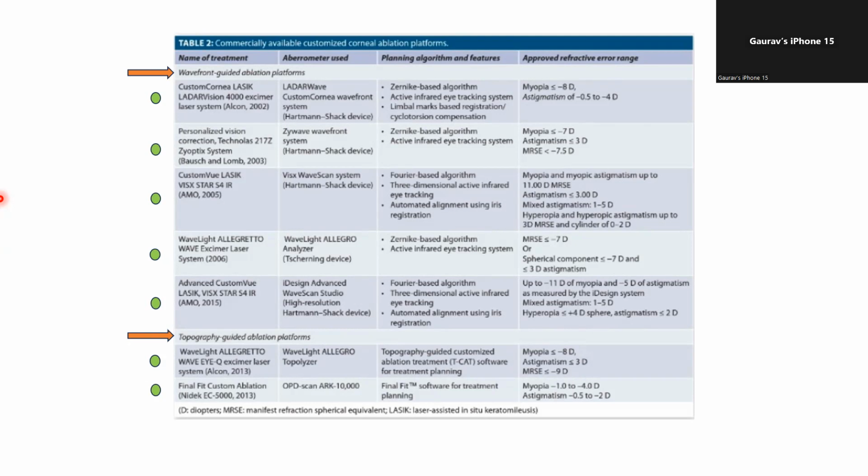So you cannot really always, because when the patient is looking at the light in our operating room, the level of illumination is changing. So that also induces a change in the wavefront profile of the entire eye. So that can also cause an error, sir.